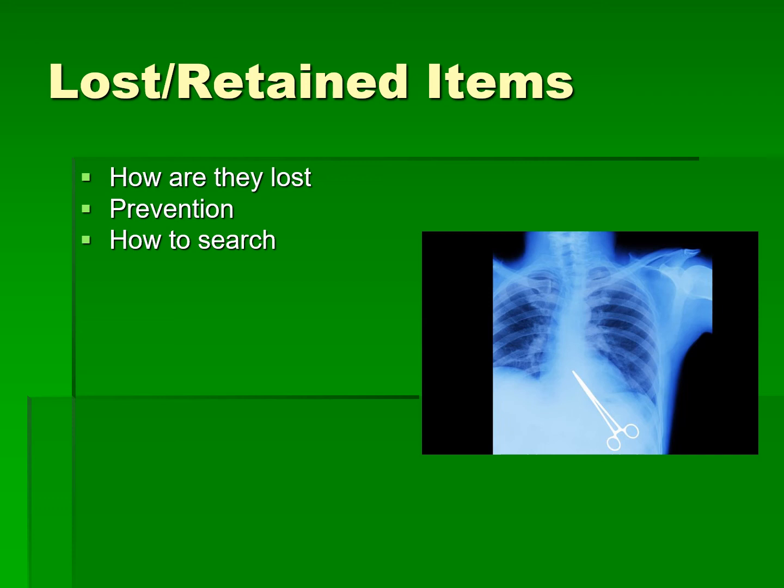If a sponge is used inappropriately, like the book gives an example, when we are doing a belly case or a chest case, and typically we don't want to give them Raytex unless they're loaded on a sponge stick, but let's say one got loose, okay? That is a way that Raytex can get lost in there.